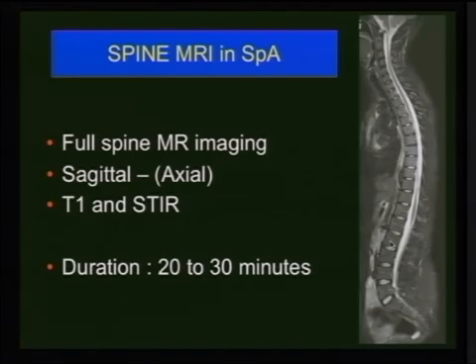You should look at the corners, especially if you are searching for spondyloarthritis. The spondyloarthritis starts as enthesitis at the site of attachment of the capsule or the Sharpey's fibers. So these areas are the most pronounced areas to be affected. So start searching for these changes in here.